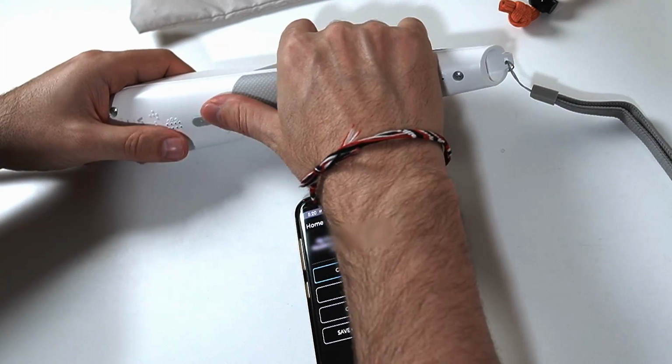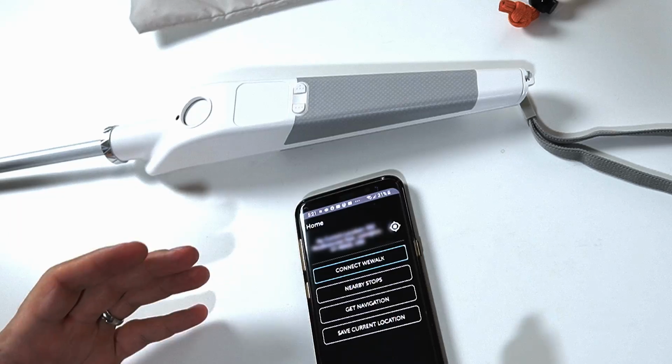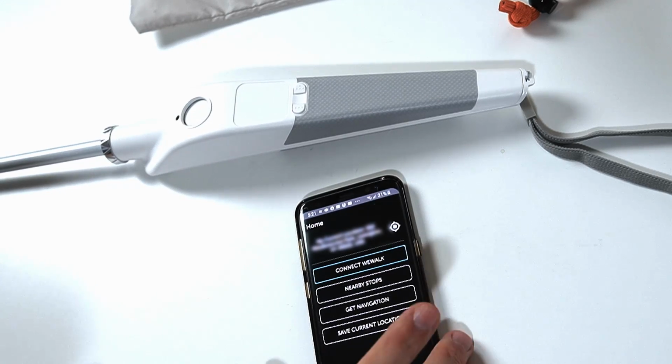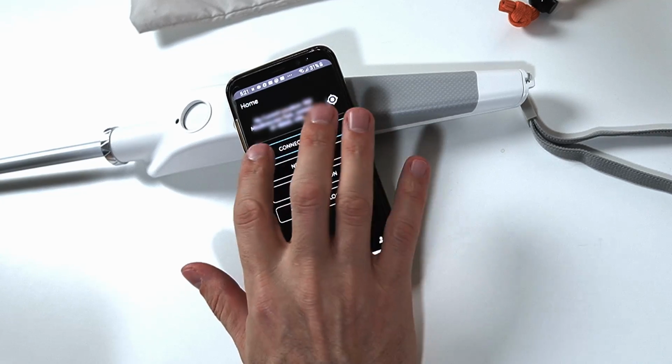So I'm going to long press the power button. It detects my hand when I put it above the cane, and it starts to vibrate. Whenever you turn it on, it's automatically in object detection or obstacle detection mode. Let's go ahead and connect.